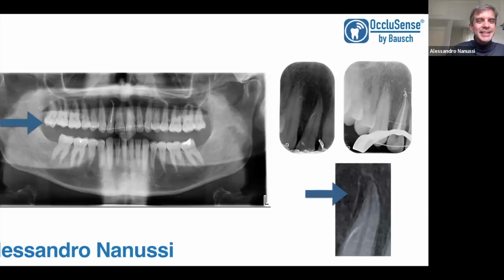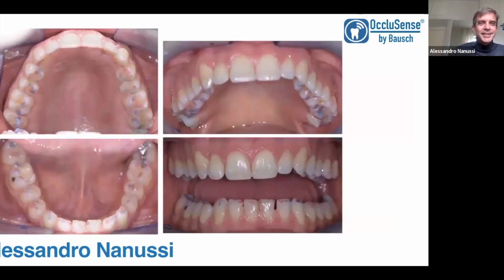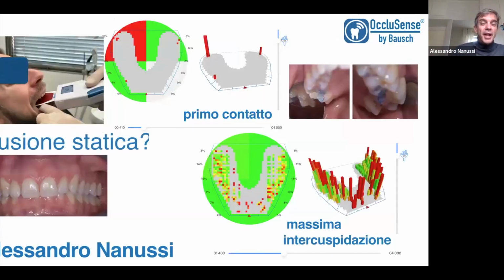Thank you, Vladimira. Well, we did an endodontic treatment. We splinted the teeth with an elastic system, but also we have to check the load on the teeth. Well, the patient at the time is in good health. He asked us to have orthodontic treatment because there is a little difference of position of the lateral incisors, but we are worried about the contacts.